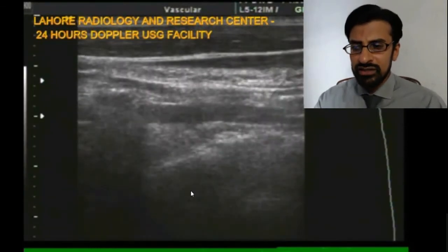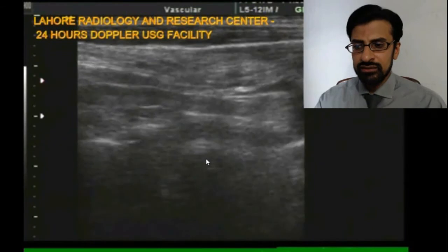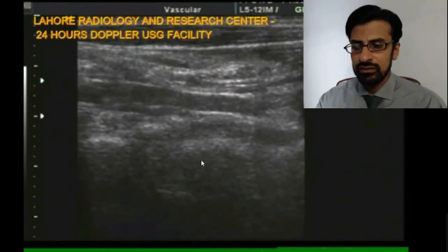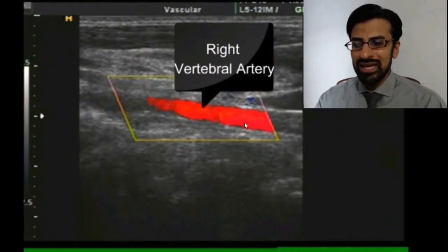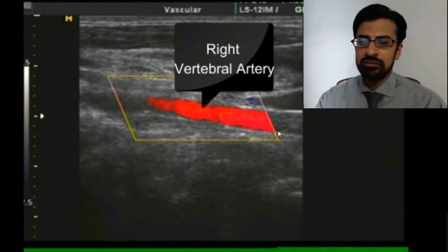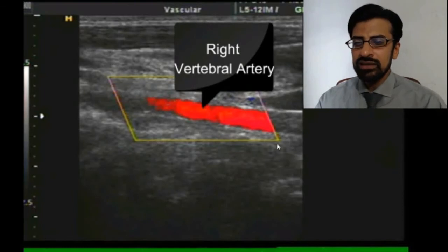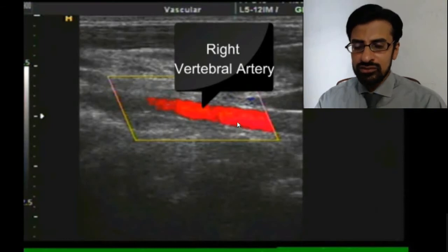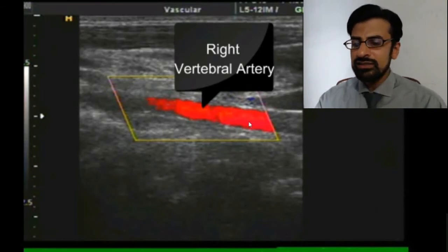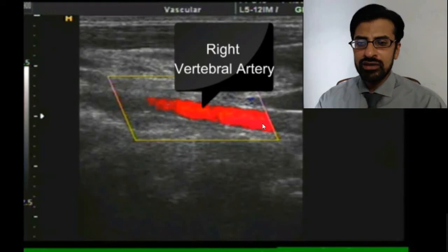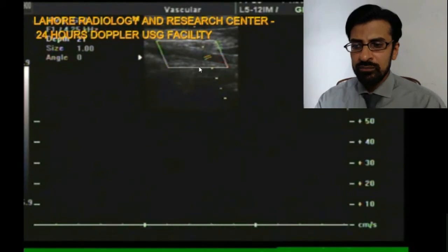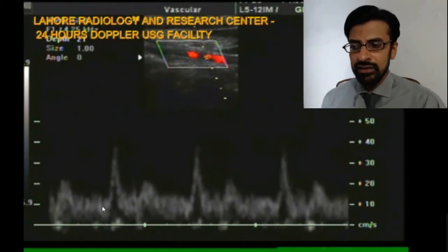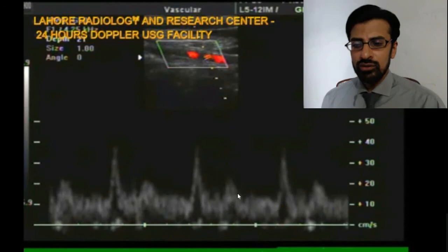Then we traced the vertebral artery on the right side. When we put the color box over the vertebral artery, you can appreciate the red color within the vertebral artery with the same settings. This means the direction of flow within the right-sided vertebral artery is the same as in the common carotid artery. When we applied pulse Doppler to the vertebral artery, it showed a normal low-resistance waveform.